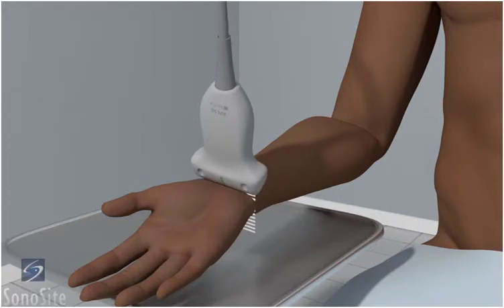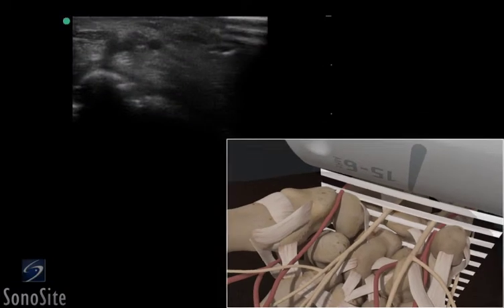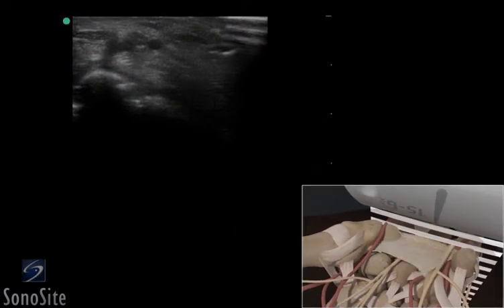The transducer is placed over the wrist crease in a transverse fashion with the orientation marker directed toward the patient's right. The flexor retinaculum spans the wrist structures and is seen as a band-like structure. The bright hyperechoic surface of the lunate forms the most posterior boundary of the volar wrist.